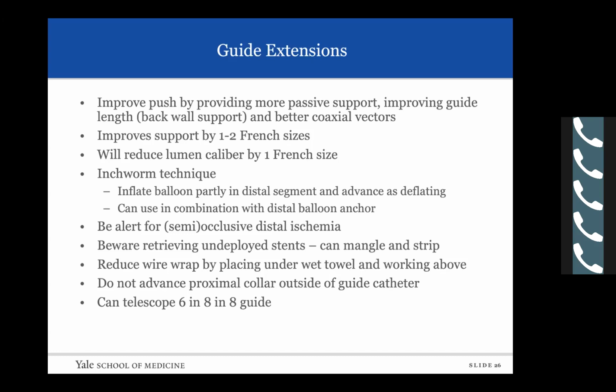One of the issues that can evolve is the guide extension is a wire basically outside the Y-connector, and that gets wrapped up with the wire that's down the coronary. So remember to just put it under a wet towel and pull it out of your working field. Usually not an issue to advance the proximal collar outside of the guide catheter unless you're working way down a vein graft, but that is one thing you really don't want to do.